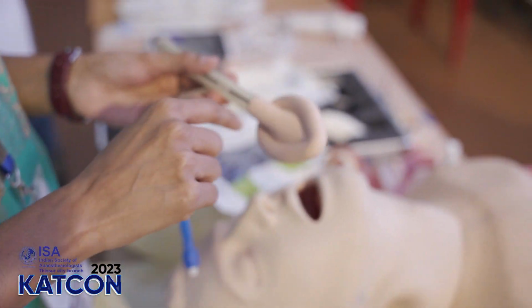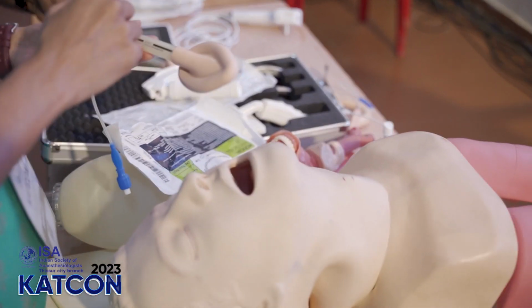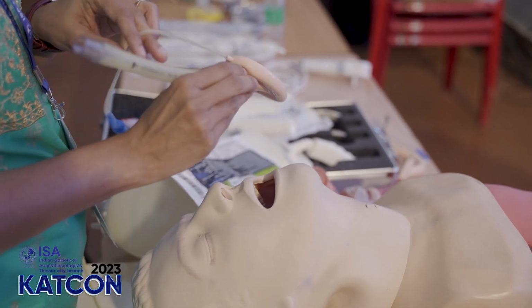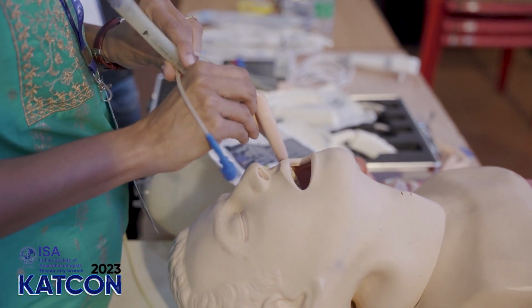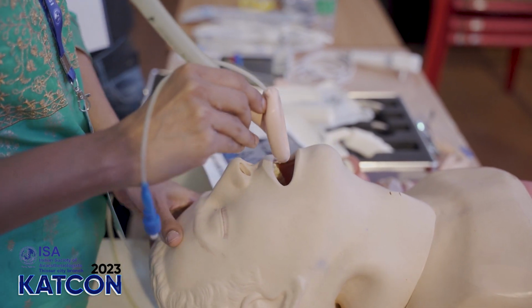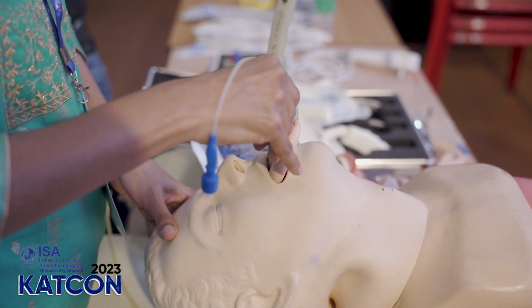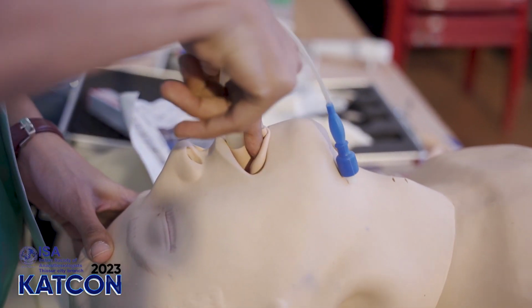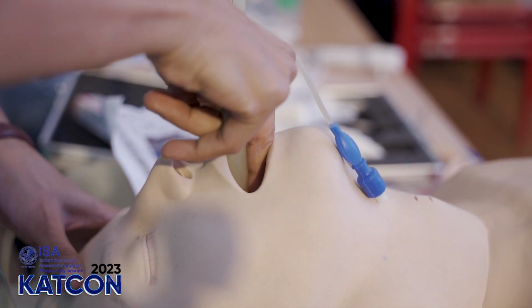The method of insertion is quite easy. Lubricate it well using a jelly. She is holding it just like holding a pen. There are different methods of insertion. This is one classic method. She is pushing towards the hard palate.